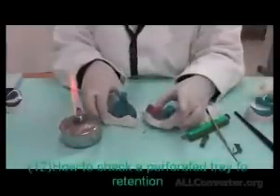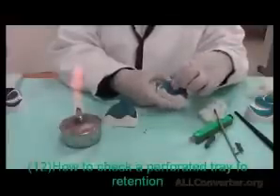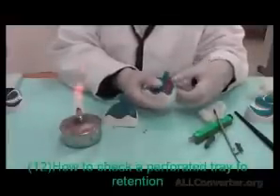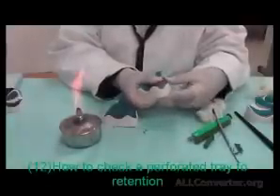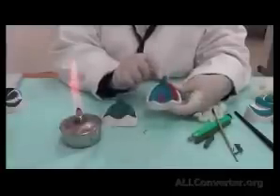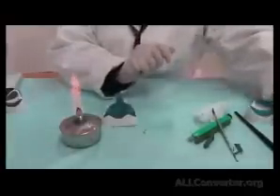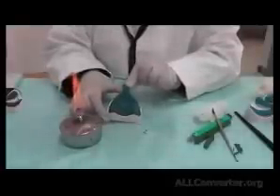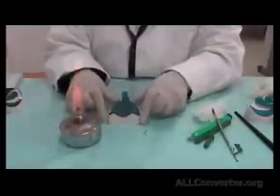Now, if I have a perforated tray, because air can go through the holes, this is why we need to add utility wax before we add the green stick in the very beginning, where we said that if we have holes ready for us in the tray, just cover them with the utility wax before you do the border molding step to make sure that air does not go through. So once I want to perform the test of suction, it will become positive here. But with holes, the air will come through the holes. So just to make sure that we now understand what the seal is. Denture seal. All around the green stick has taken a correct impression of tissue at function and is totally sealed.